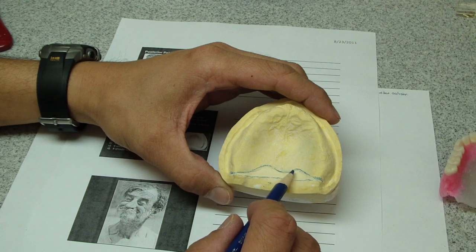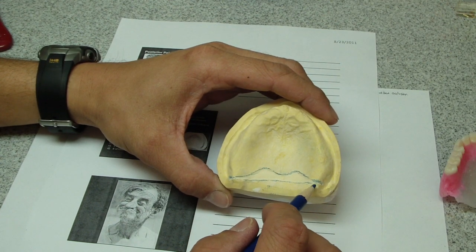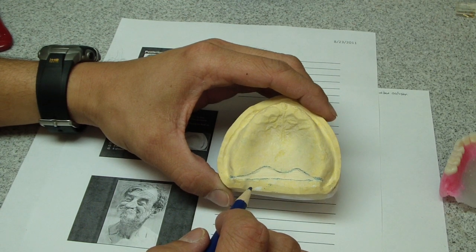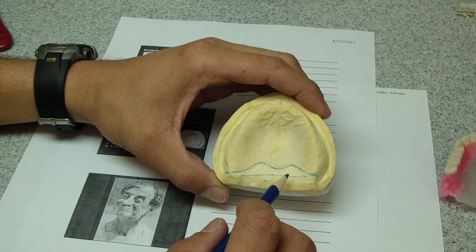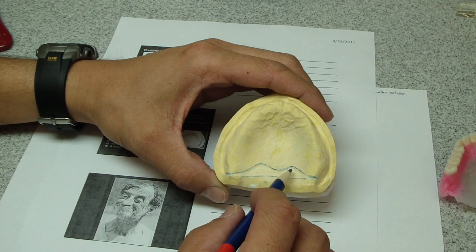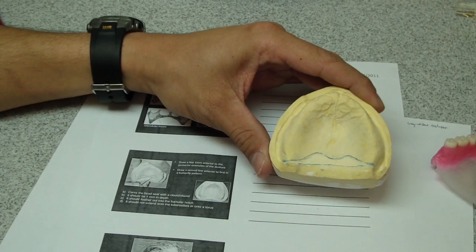The reason it's this shape is that if you need to adjust any part of this or it gets polished away, you don't lose the entire seal. What I was taught was a single line all the way across the denture base, and if I needed to adjust it or polish it, for whatever reason, it's lost, then the refrigerator door, as Dr. Dray suggests, is lost. So we have a sort of butterfly, and I'm just going over my notes to make sure, and this is thanks to Dr. Dray, our resident prosthodontist.